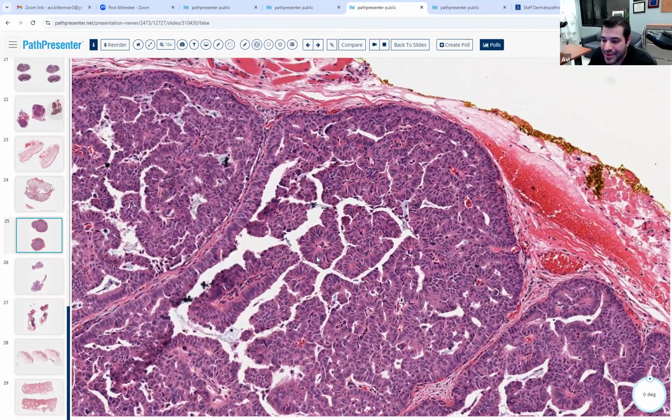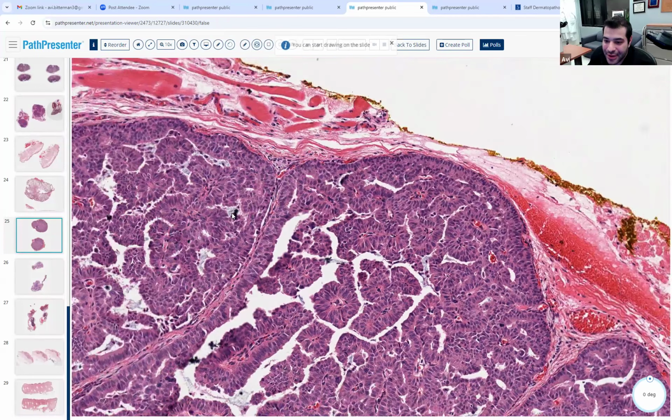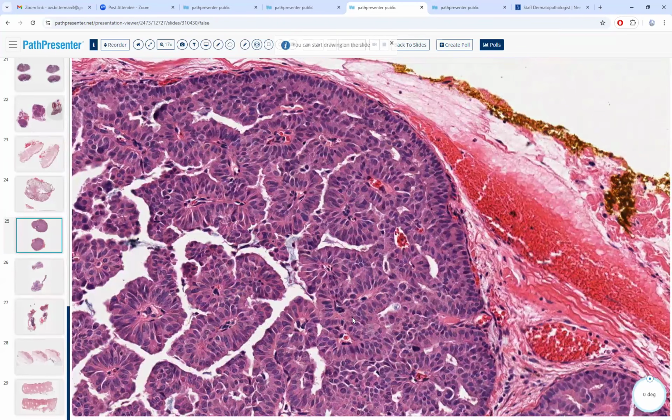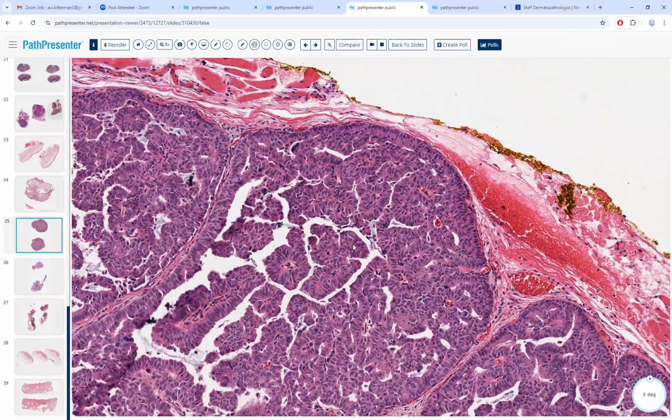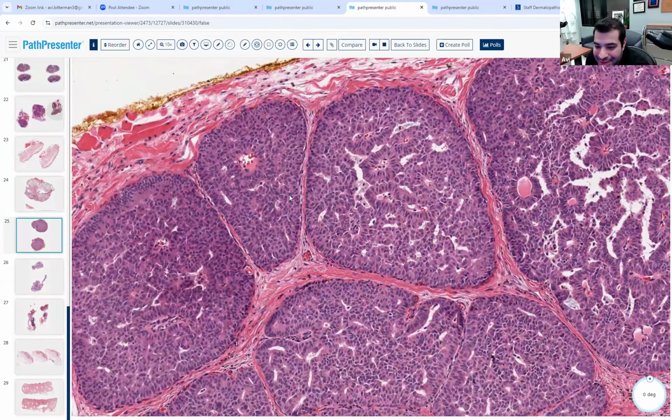You notice how some of these areas have these pseudorosettes? Sometimes you could see a cribriform architecture here. Sometimes you can see pseudorosettes. Acrospiroma, right? I'm sorry? No, I think I'm very wrong, but I said acrospiroma, but I think I'm very wrong. No, not an acrospiroma.